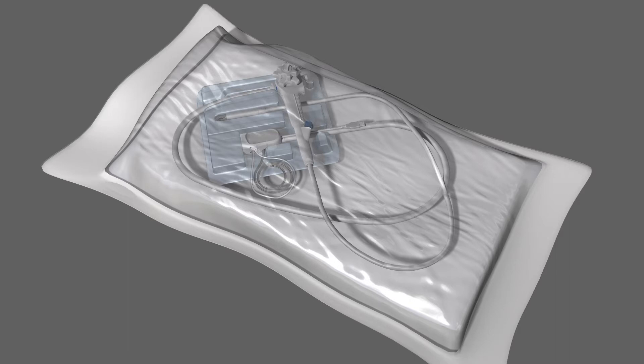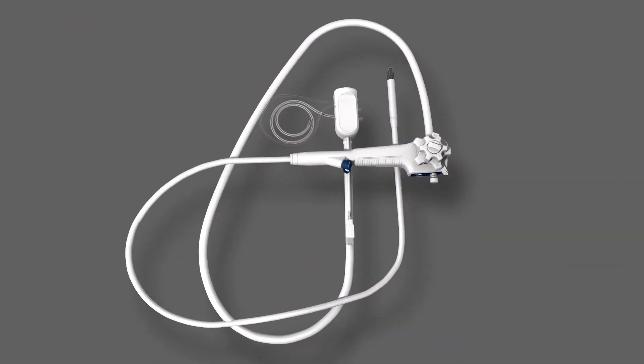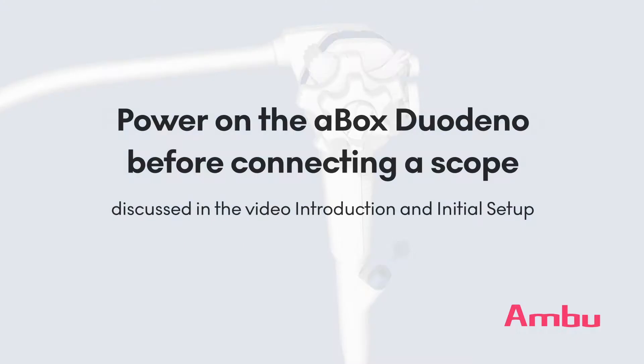Place the unopened A-Scope Duodino packaging on sterile surgical chucks or a similar clean surface before opening. Carefully peel away the pouch packaging. Remove the protective elements from the handle and the distal end of the scope. The A-Scope Duodino is equipped with a 4.2 mm working channel that allows standard length endotherapy instruments of appropriate diameter to be passed.